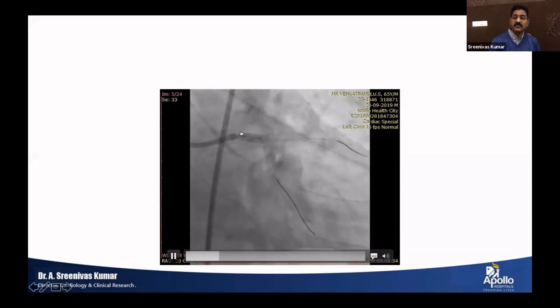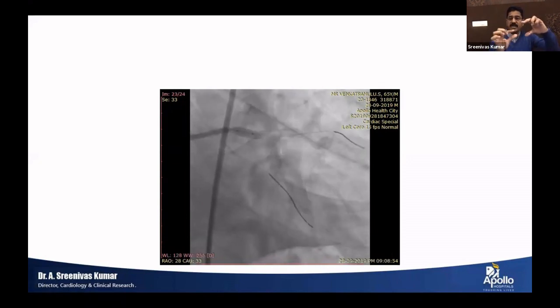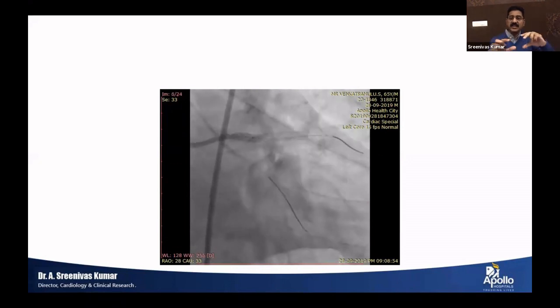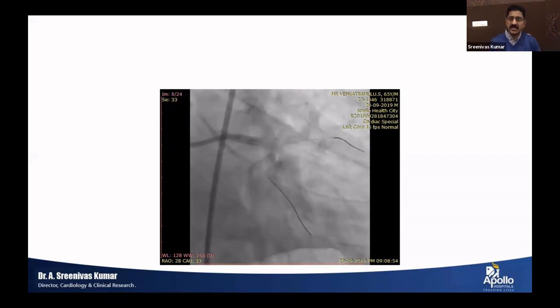But when you're in the process of doing it, in the earlier version of the stents, when you are expanding proximally, they used to become narrow distally. But with the changed anatomies, now even if you expand there, it remains expanded there. And again, below, the stent anatomy does not get distorted, if you are within the expansion limits that I mentioned.